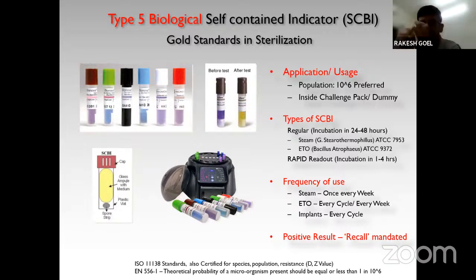And after how many days, like if we have sterilized today, how many days can we use the same set without re-autoclaving? That would depend on a lot of conditions. But one critically important thing is the packaging that you're using. If you're using a drum, the universally accepted standard is only 3 days. That is, after 3 days, you will need to re-autoclave. If you are using linen, again, 3 days is the time. There are some hospitals which keep it for 7 days also.